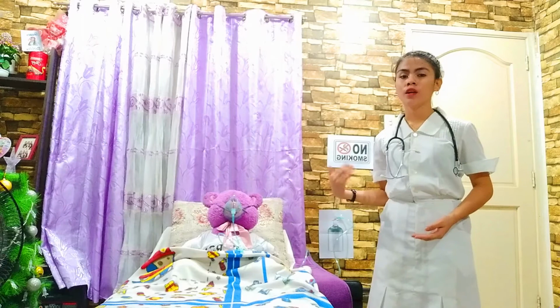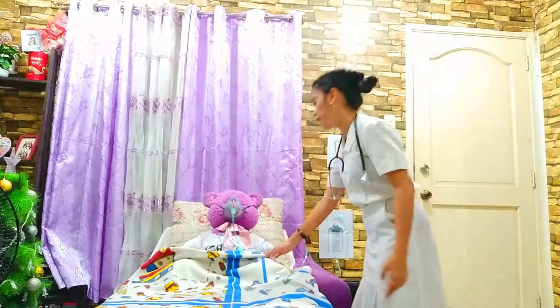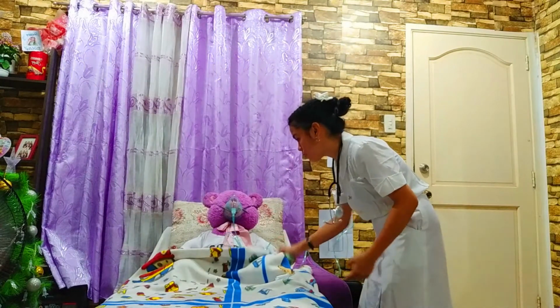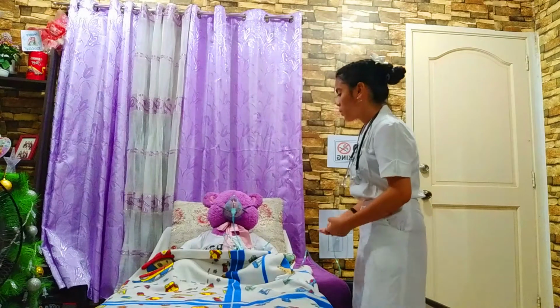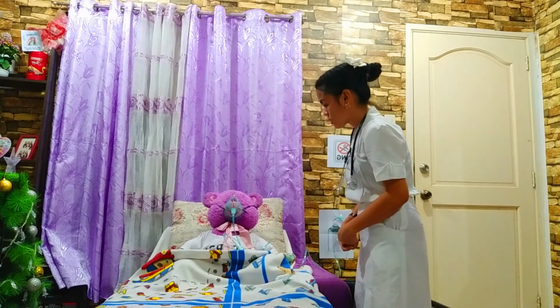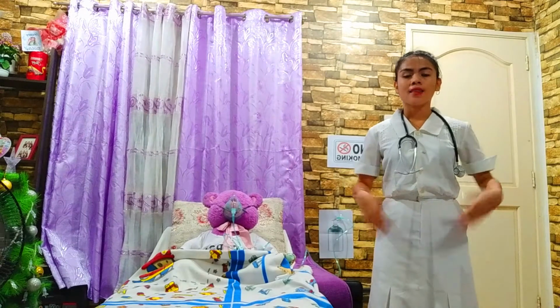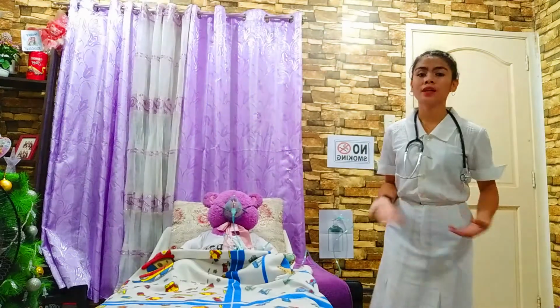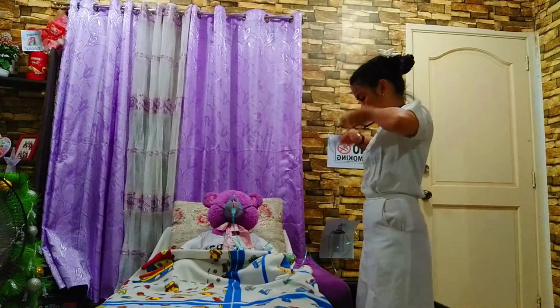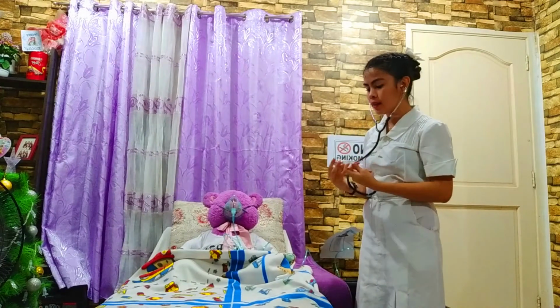For the evaluation, we need to evaluate the client for her immediate response to the administration of the oxygen. So, ma'am, are you comfortable po with the face mask? Okay. So, you have enough supply of oxygen naman po. Okay, that's good. And then, we also need to assess her vital signs after administering the oxygen. For the breath sounds, we need to auscultate again the client's chest.